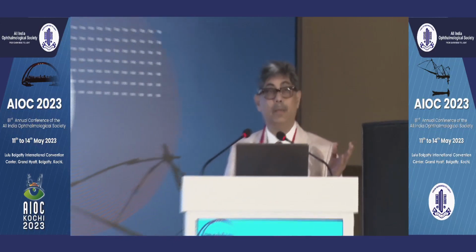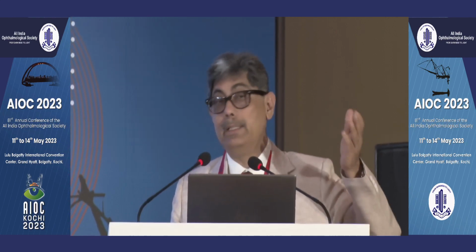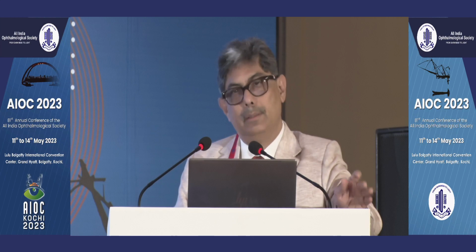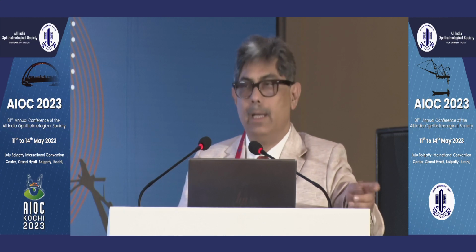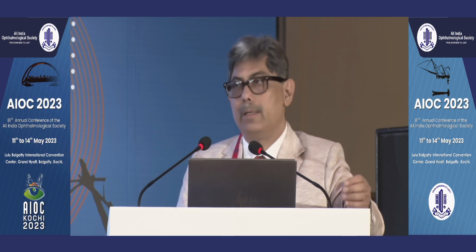We did it, and then we see those patients. Although during those days the central opening was also not there, the vault is still present, and there is no development of cataract. But definitely the incidence of cataract with the earlier type of lenses was high, and we come across cases of cataract in such eyes now.